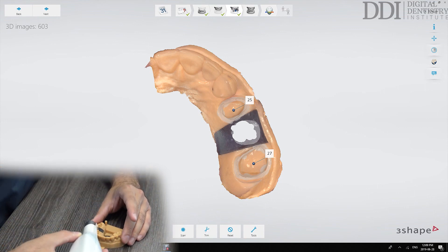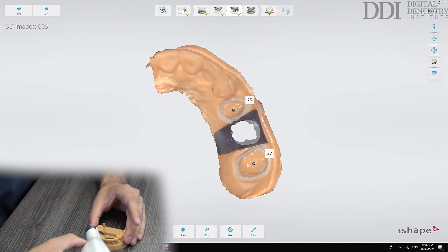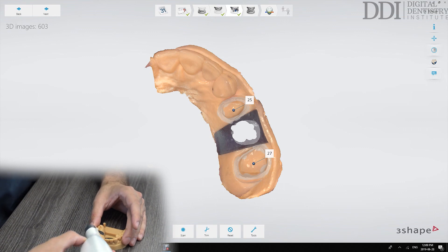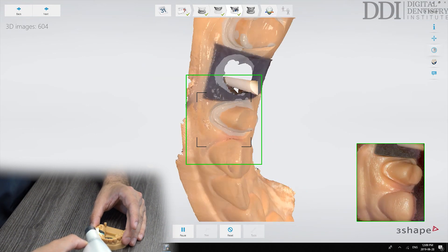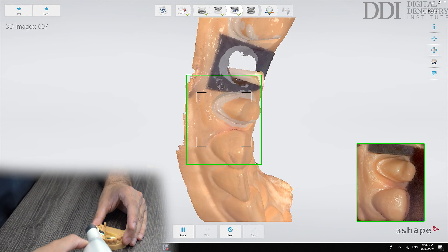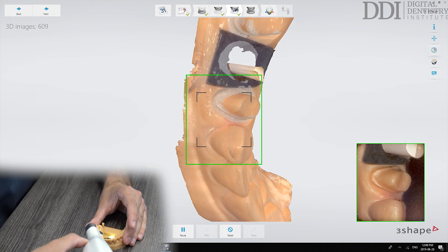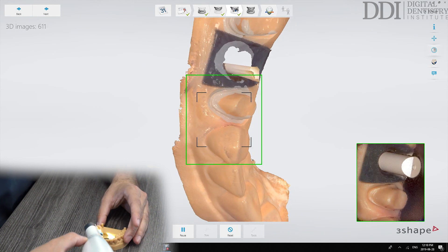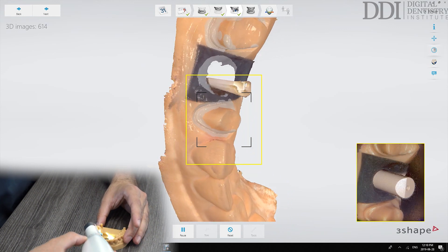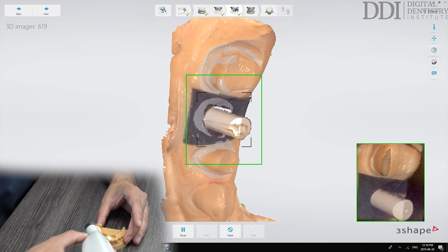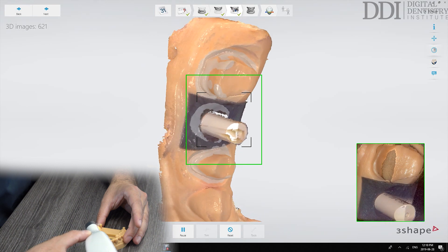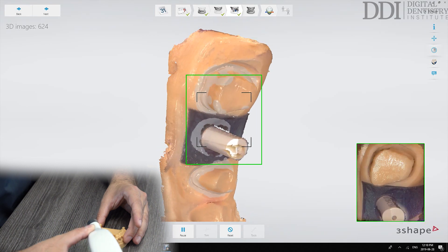We'll start at a point that is common between the two scans so I'll start at the premolar site to initiate the scan. Once the scan is initiated I'll move over the scan body and make sure that we capture all the surfaces of the scan body.